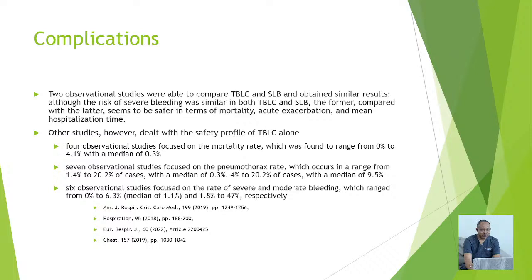Rarely one may be forced to abandon a procedure if, for instance, the patient becomes unstable or the patient is bleeding too much. You control the bleeding, and you may even postpone the procedure or abandon it altogether.